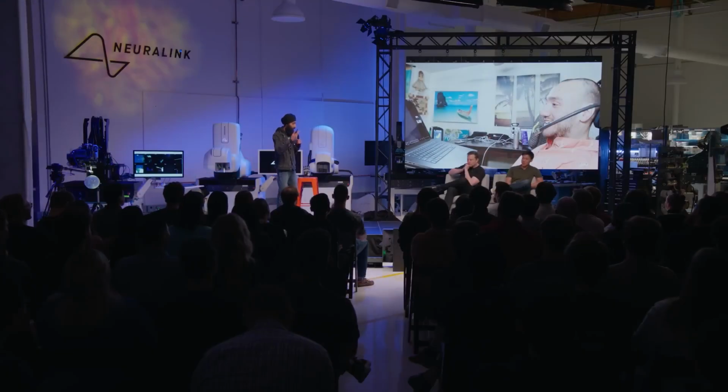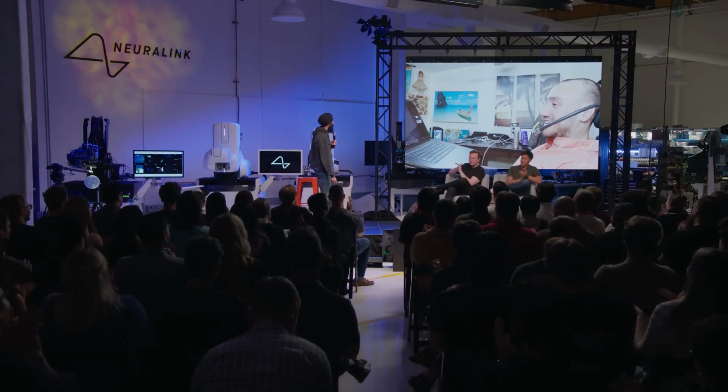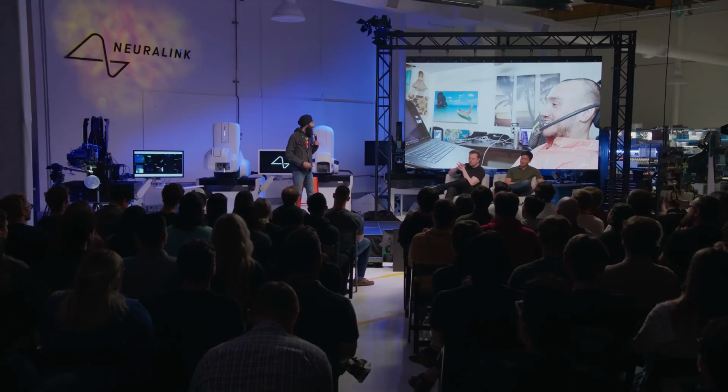The second upper part with more computing power and a bigger battery, above it closing the skull. This way you can replace only the top part without cutting threads. In the first case, the cut threads won't migrate through the brain because scar tissue forms and holds them forever. The brain functions normally. In the second case, updating only the top part will be fast, less than half an hour.